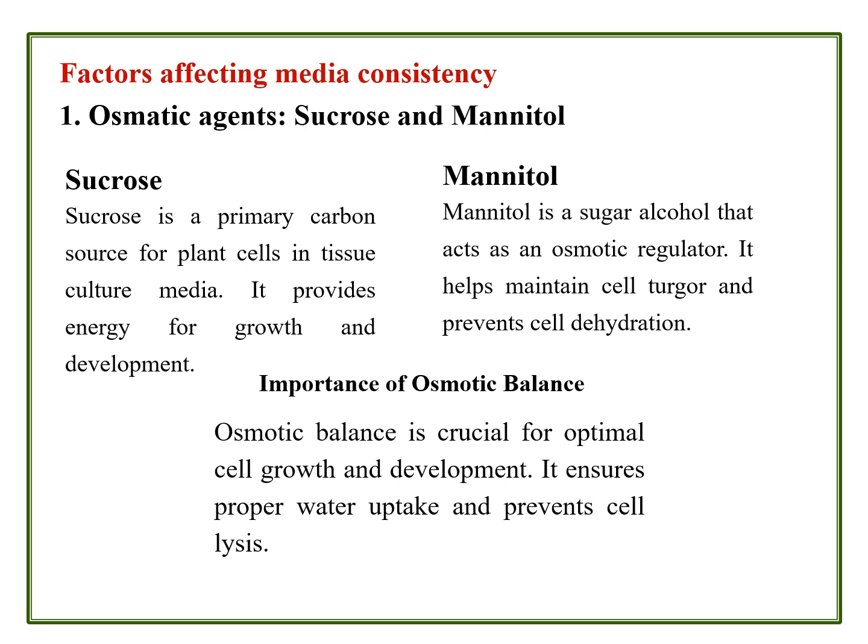It provides immediate energy for growth and development. Next, mannitol. Mannitol is also a sugar alcohol that acts as an osmotic regulator. It's a wonderful osmotic regulator for some plant species and helps maintain cell turgor pressure and prevents cell dehydration.